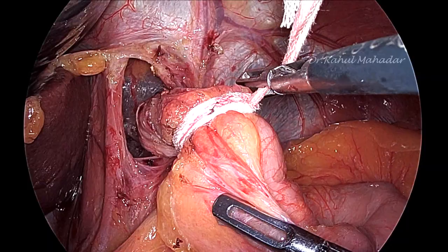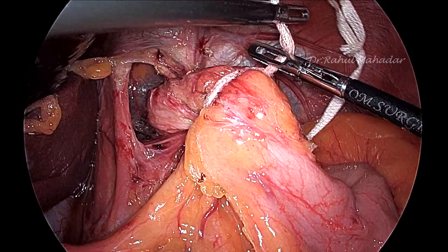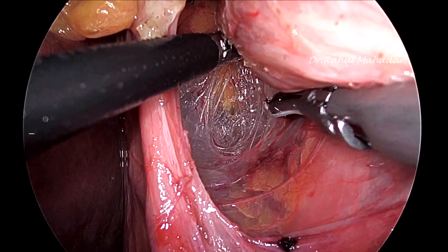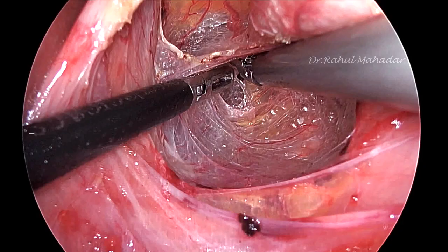So now ask the assistant to catch hold of this umbilical tape. And then you carry out the dissection transhiatally. Now you can very well see the posterior vagus. You have to lift the posterior vagus above, and below that you have to dissect and separate it from the aorta. Now you can see the aorta posteriorly.